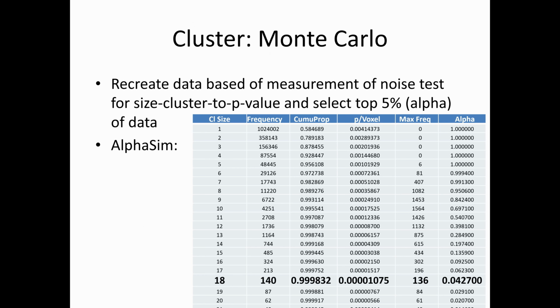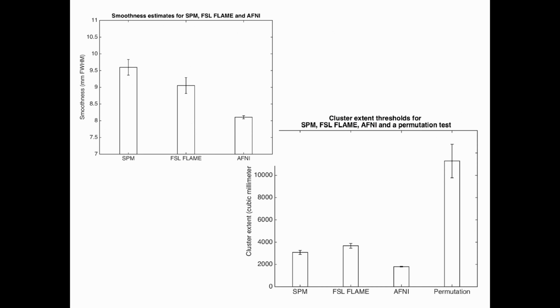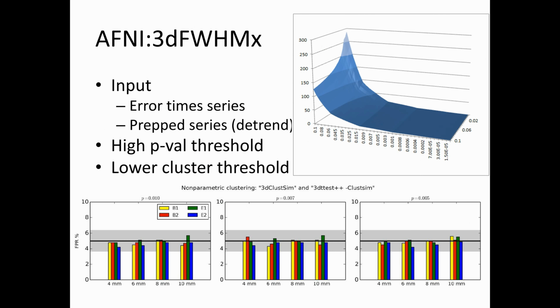So that's what you're seeing the effect of here: as your p-value gets really tiny, your noise is never going to get clusters that are 300 voxels in size. So your threshold of what would count as significant on that Monte Carlo drops down as it gets harder for your noise data to achieve those levels.